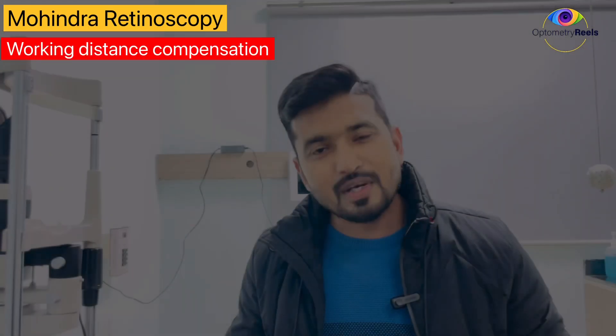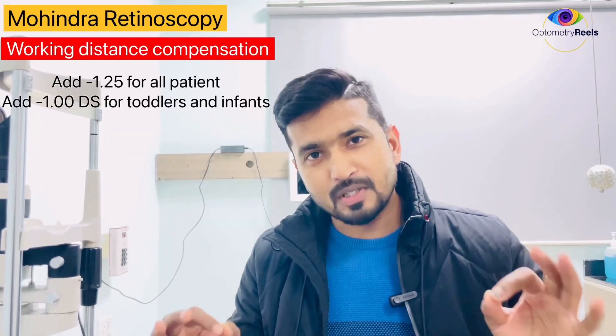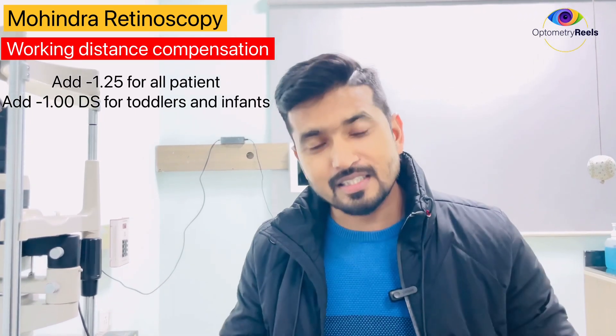Once the reflex is neutralized, you can get the net retinoscopy value by compensating for your working distance. The correction factor for this technique is minus 1.25 for all patients, and minus 1 for toddlers and infants. You need to add this value to your neutralized or gross value to get the net retinoscopy value.